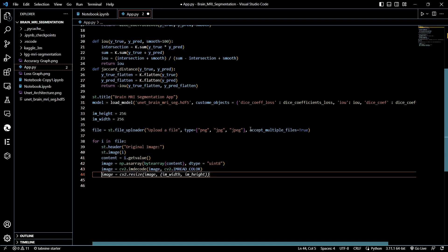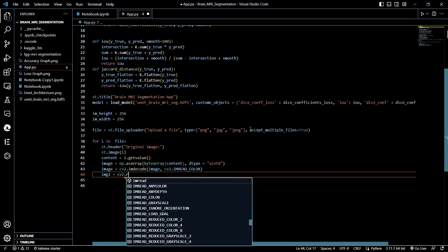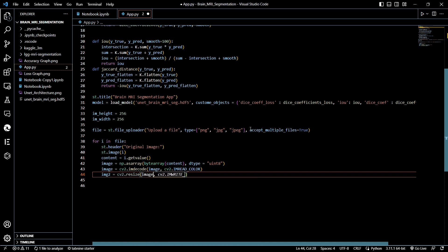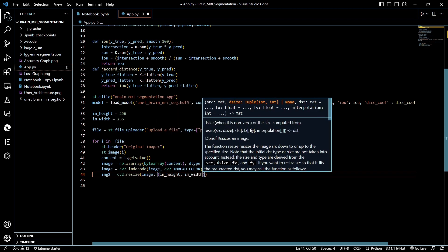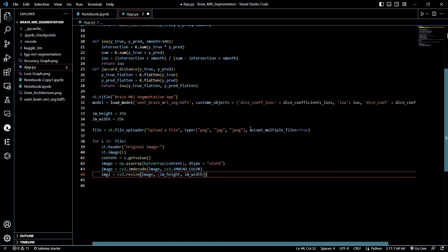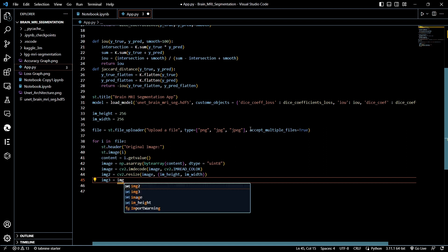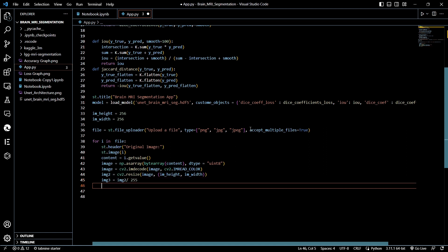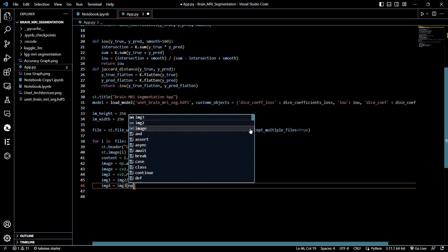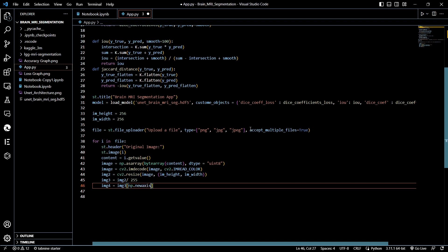We then use cv2.imdecode() with the uint8 array and cv2.IMREAD_COLOR to decode the image. Next, image2 is created by resizing with cv2.resize() using the image_height and image_width parameters. Then img3 is image2 divided by 255 for normalization, and image4 is img3 expanded with np.newaxis.